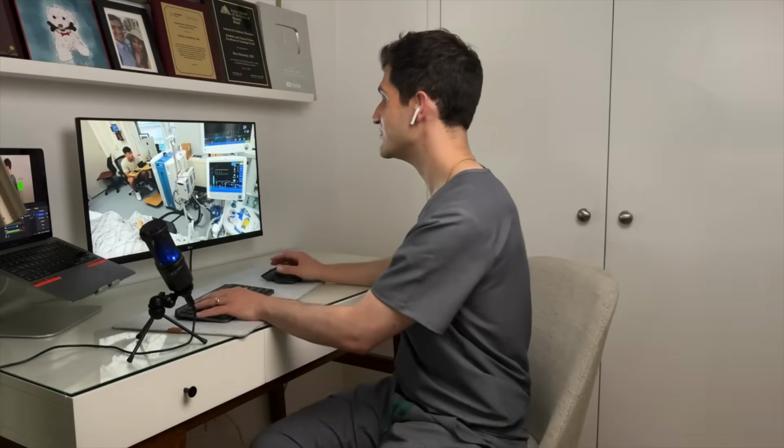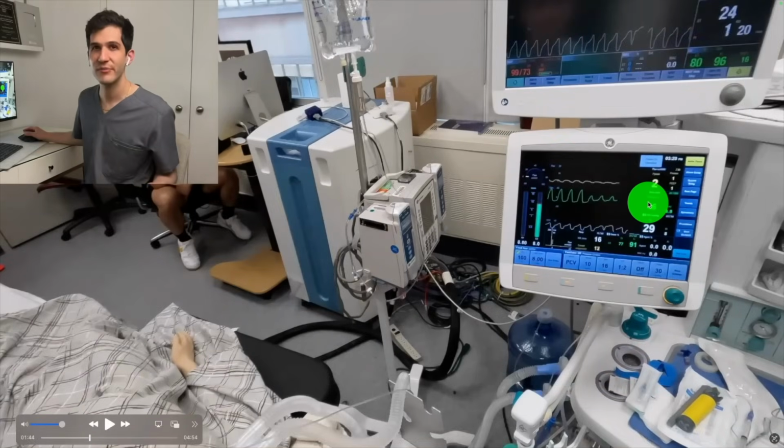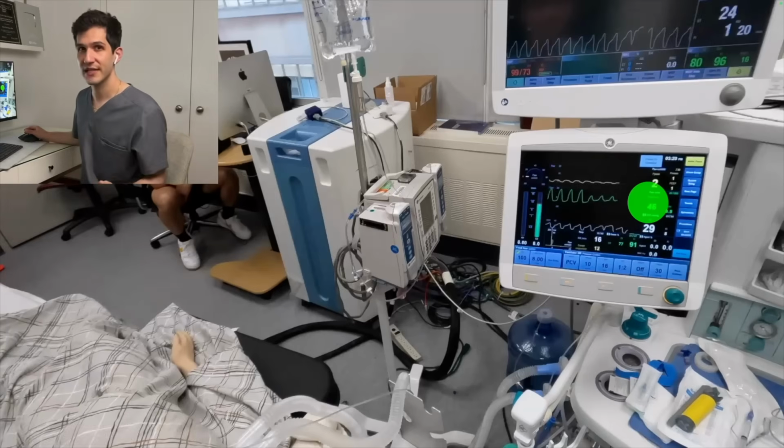Now you can hear that noise in the background. It's a little subtle, but this is actually what's called inspiratory stridor. And what that means is that there is something that's blocking the free passage of air between the mask and the patient's lungs. This is concerning for me because that potentially compromises my ability to continue delivering oxygen and anesthesia to this patient. Along with this, you can see on the screen that the patient's tidal volume has now gone down to 46.